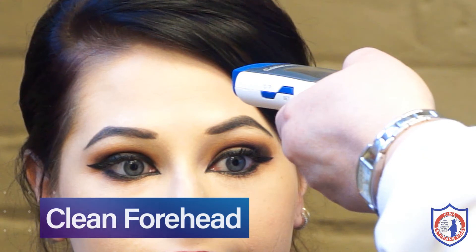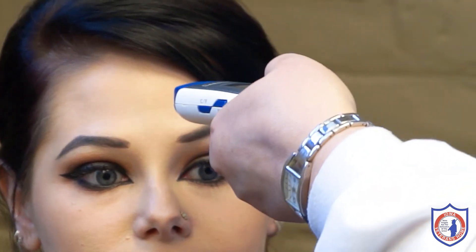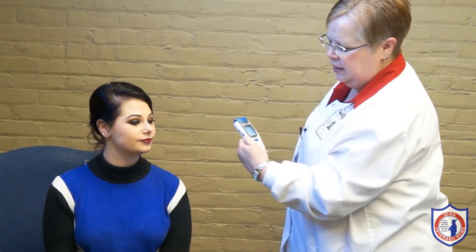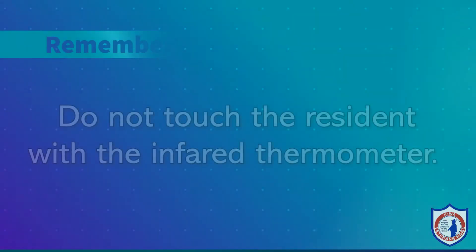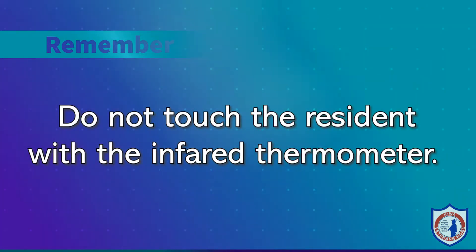Using the infrared thermometer, make sure there is no hair or oil on the forehead. Turn on the thermometer by pushing the blue button on the top. Point at the resident's forehead a half to one and a half inches away. Push the blue button again and it will give you the reading. Remember, this thermometer does not touch or make contact with the resident.